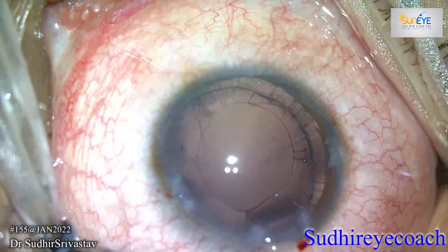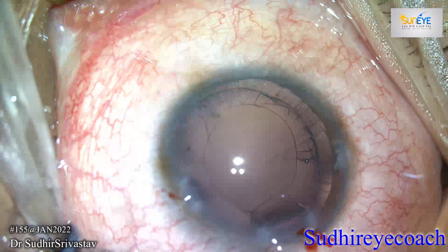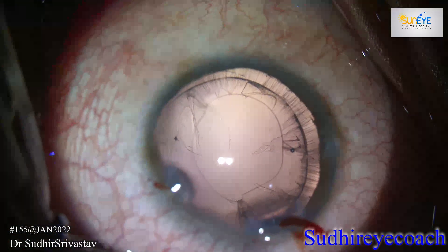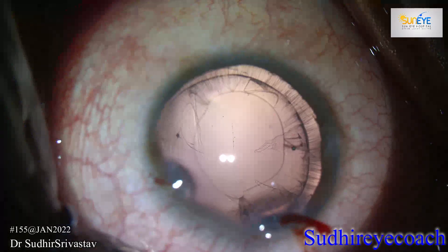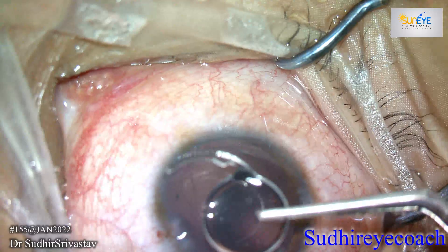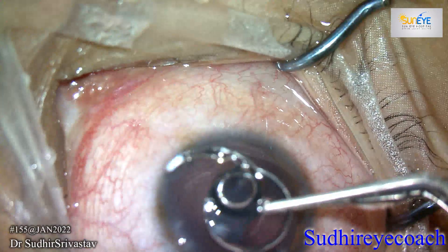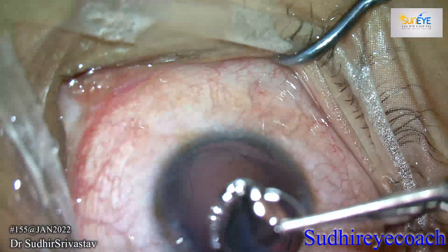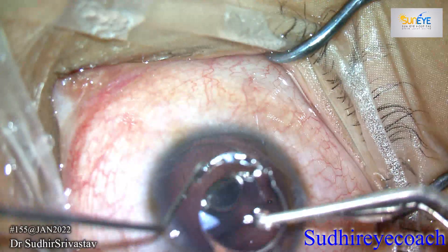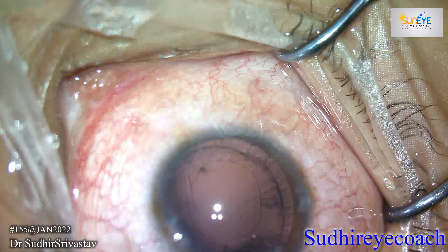Now I was ready to implant the intraocular lens, but which implant to use? Before surgery I kept all options open. After analyzing the size and stability of the capsular bag, I decided to implant a hydrophobic intraocular lens in the bag. I assessed and compared the size of the IOL and the capsular bag, and initially considered trimming the haptics for better stability, but after assessment I decided to implant the IOL without trimming.